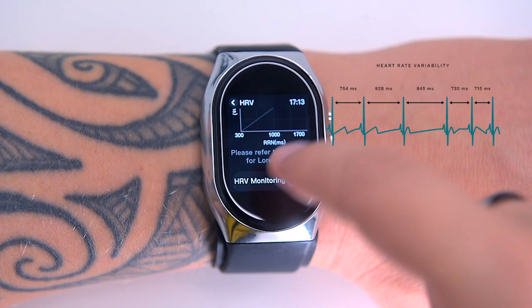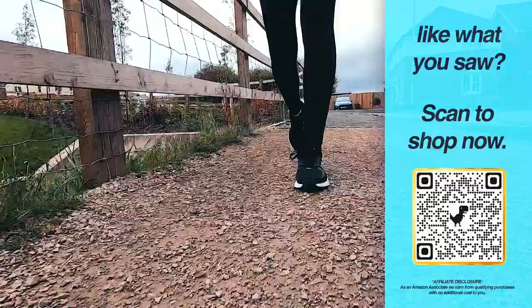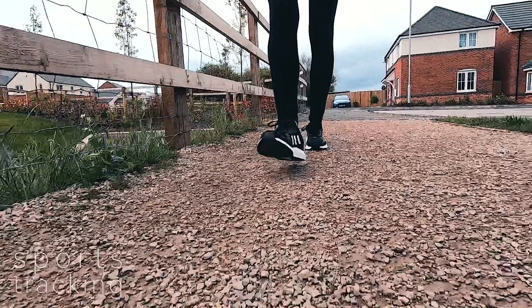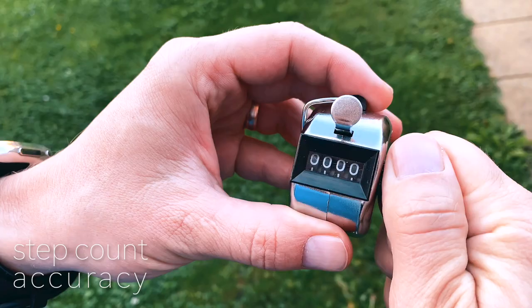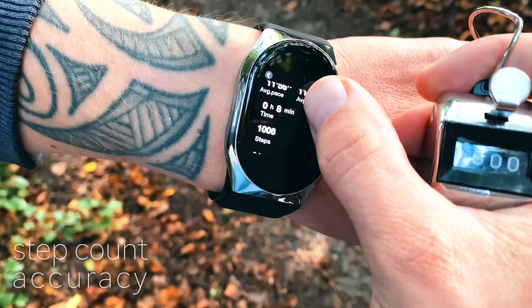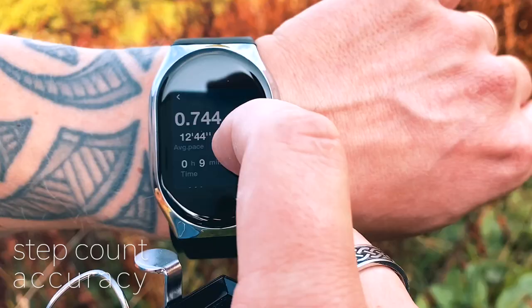The BP Doctor Pro does more than simply measure blood pressure — it does most things fitness watches do too. It will track your activity, get you notifications from your phone, set alarms, and more. It offers three workout monitoring modes: outdoor walking, indoor running, and outdoor running. The watch doesn't have built-in GPS, but it shows steps, calories burned, and total activity time. Challenging the step count accuracy against a manual tally counter: for 1000 manually counted steps, the BP Doctor Pro counted 1006 — very good. Repeating the test with various strides and speeds, it registered 1009 steps — also excellent.